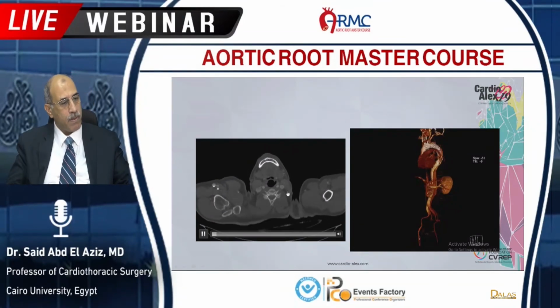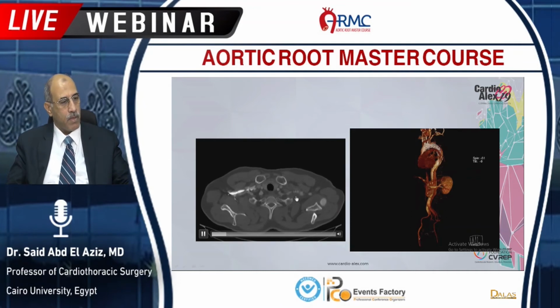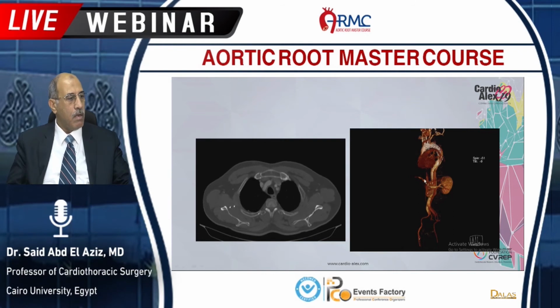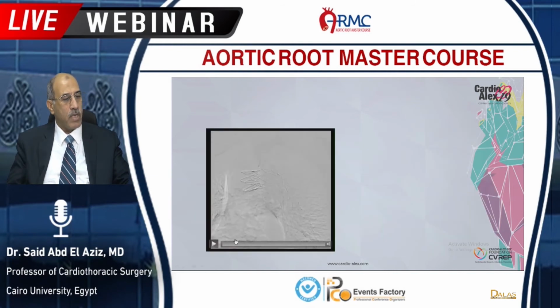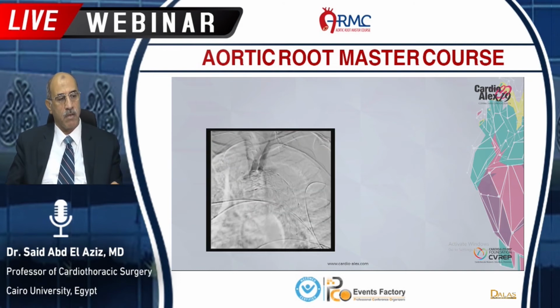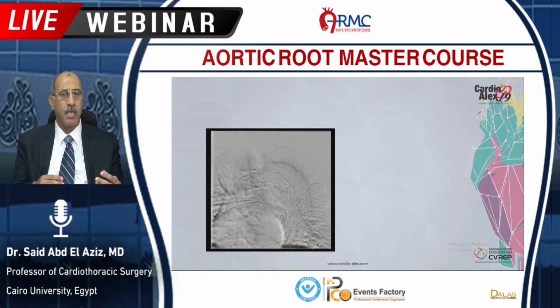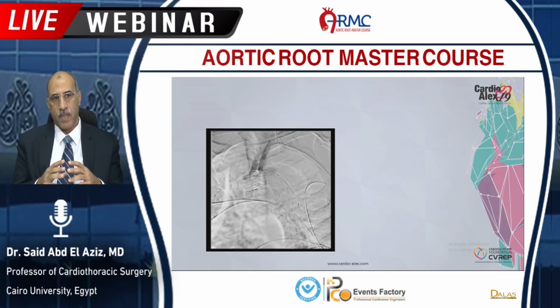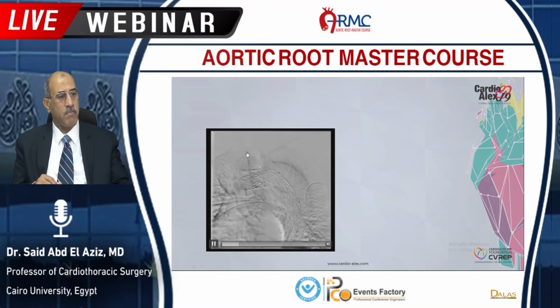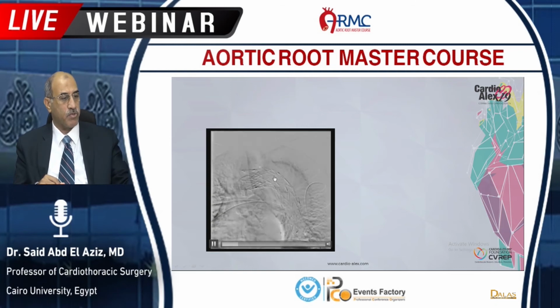Here the bypass will show up here. Yes, this is the bypass. After that, in the follow-up, we did an angio for that patient because he came to us with still the sac around the stent full of blood. So we did an angio for him. As you see here, there is a leak around the stent from the subclavian artery.